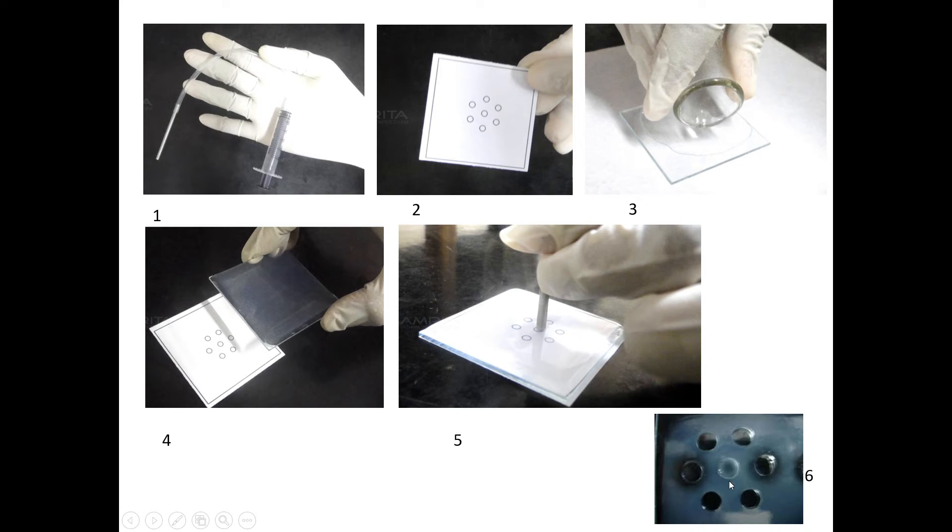With the help of gentle suction to avoid deforming the wells, you need to slowly remove the agarose which you have punched. The agarose plug should come out when you remove the gel puncher from the gel.